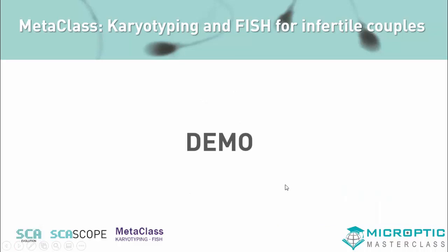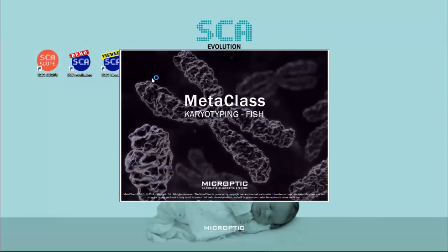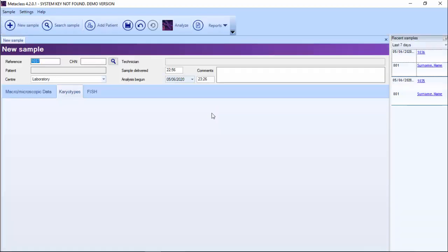Okay, so I will show you with a demo how the MetaClass system works. So I run the MetaClass software. In the first screen, it asks me the user and the password. So the system will identify what each technician will do in all the session. The first screen is to identify the sample.